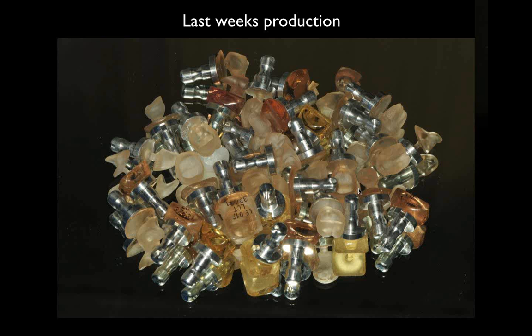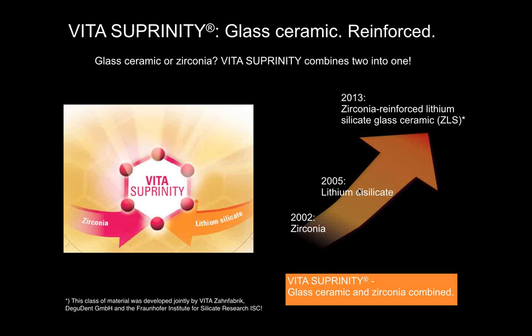This is some of the materials which we've been using, which is called Suprinity. So Suprinity, what is it? Before I explain what it is, I would just want to let you know it's a product which is basically made by Degudent, okay, made by VITA, and was basically developed jointly with the Fraunhofer Institute. It's a very famous institute in Germany. So these two companies have invested in this product to get something new on the market.